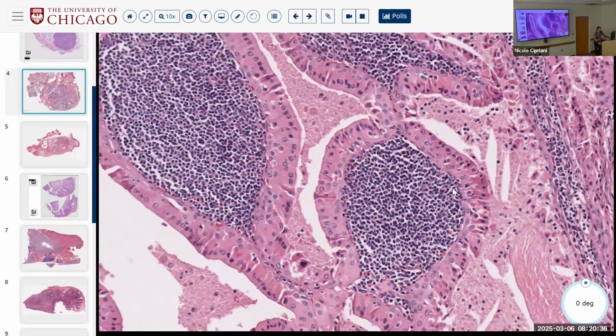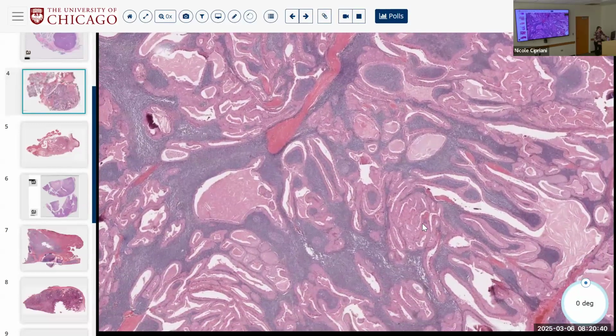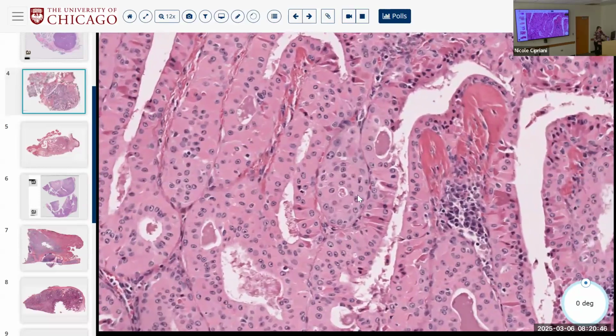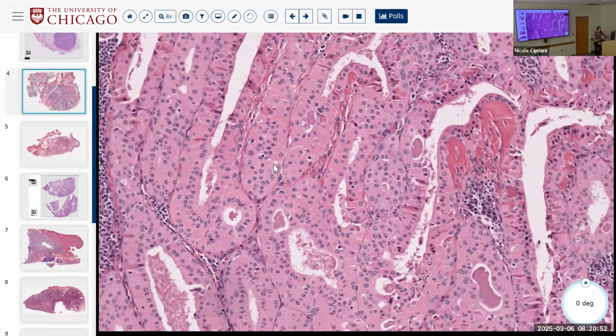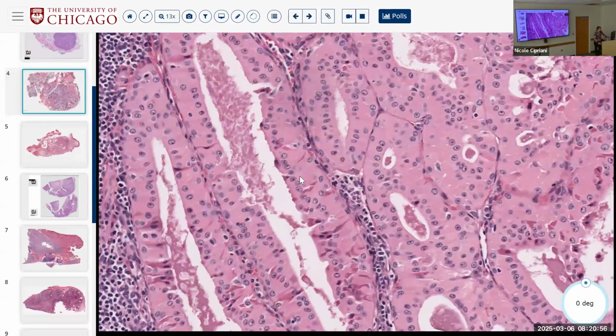And you can see some epithelial proliferation, right? Like areas like this, for example, where you're more stromal poor, and you start to see kind of nesting of these little oncocytic islands. But in general, in the well-formed areas, you should have a nice oncocytic bilayer.